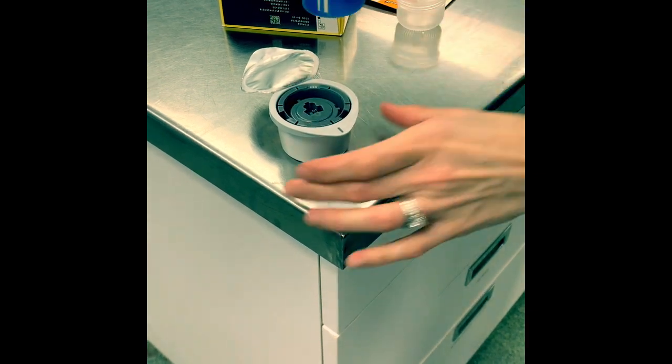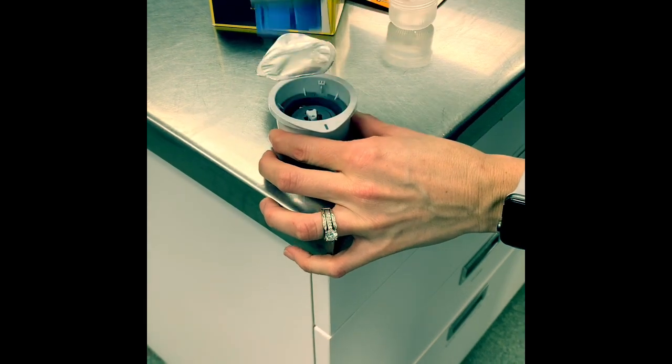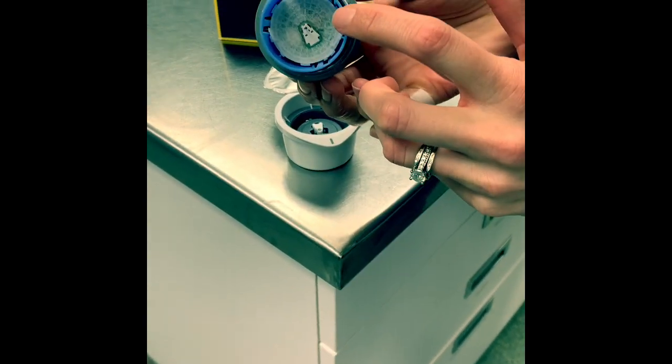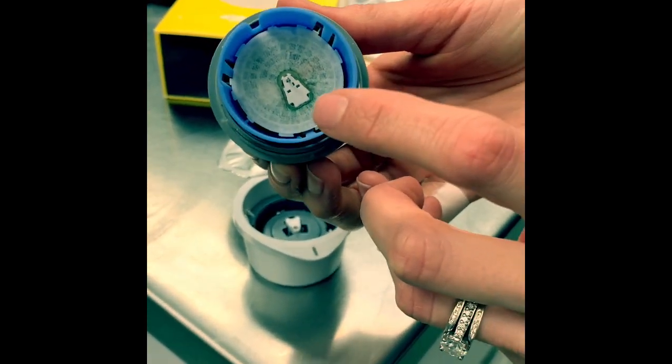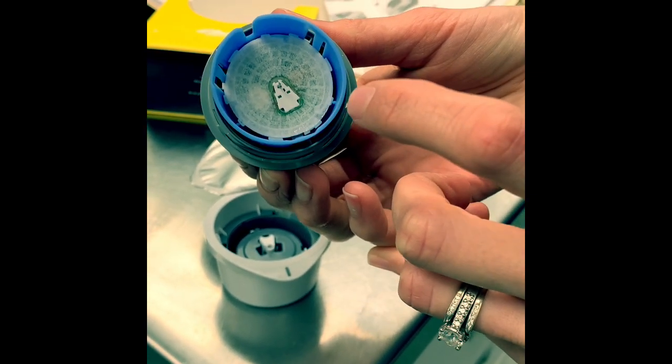We need to line up and click things in. Here's the sensor that goes in with a needle and what we're going to do is put a little bit of tissue glue on there and apply it onto his skin.